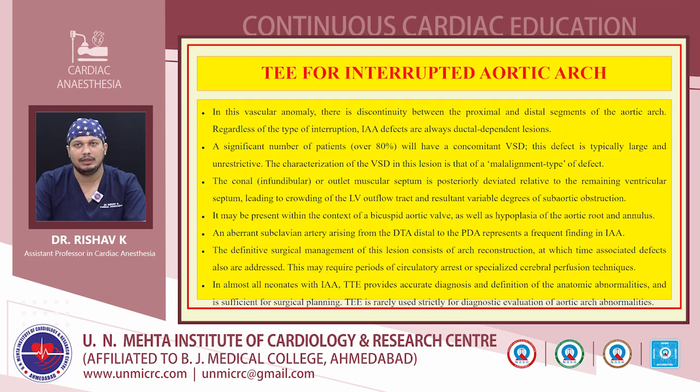So, as I have already told repeatedly, we are very much restricted with respect to the TE evaluation of the aortic arch, because TE is not at all optimal for imaging the arch and the associated vessels. So, there is a relatively limited role of TE in examination of aortic arch lesions.